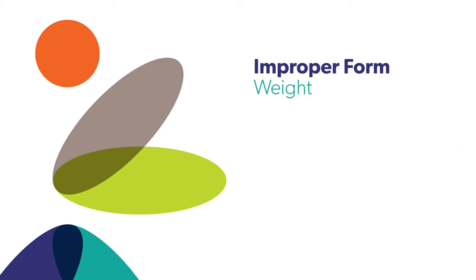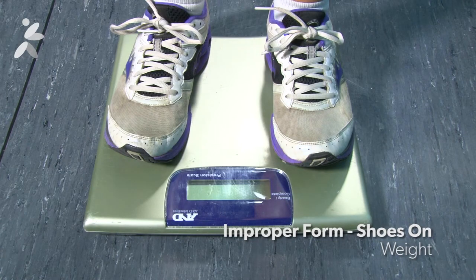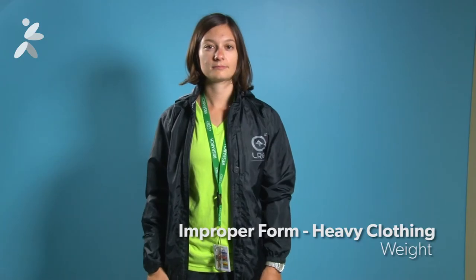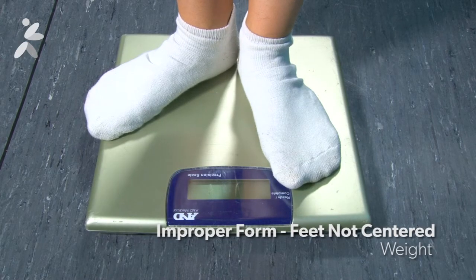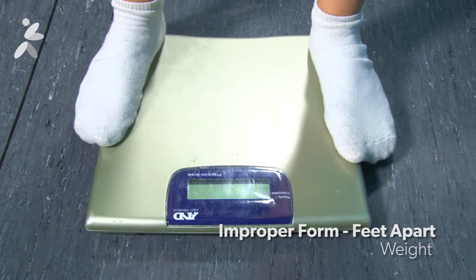These are common mistakes made during the test: shoes on, heavy clothing, feet not centered, and feet apart.